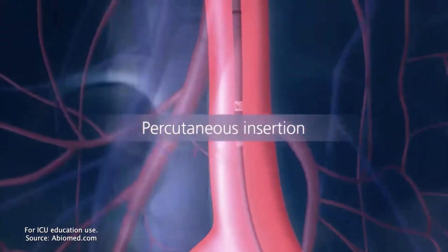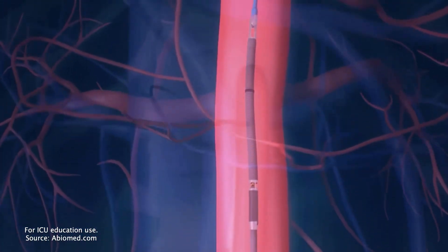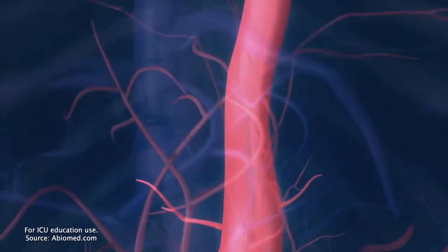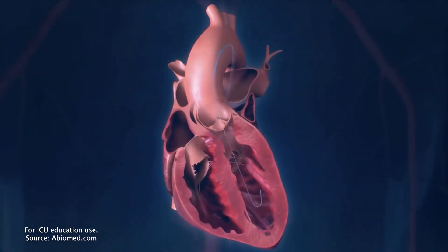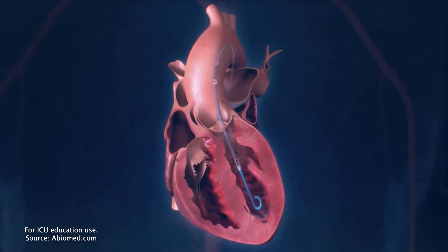The Impella system is placed percutaneously through the femoral artery using a monorail technique and a standard pigtail. It is advanced across the aortic valve and into the left ventricle.